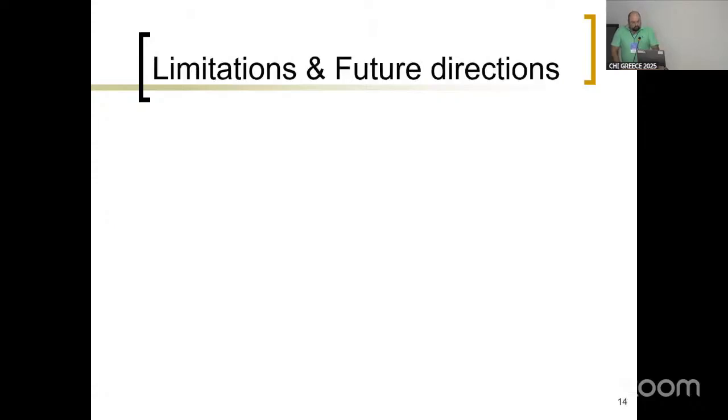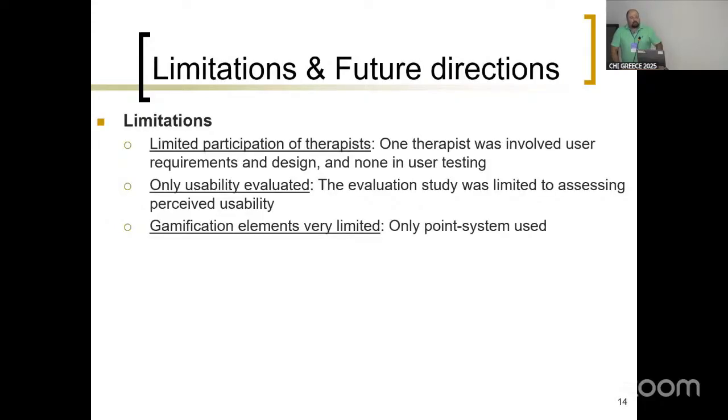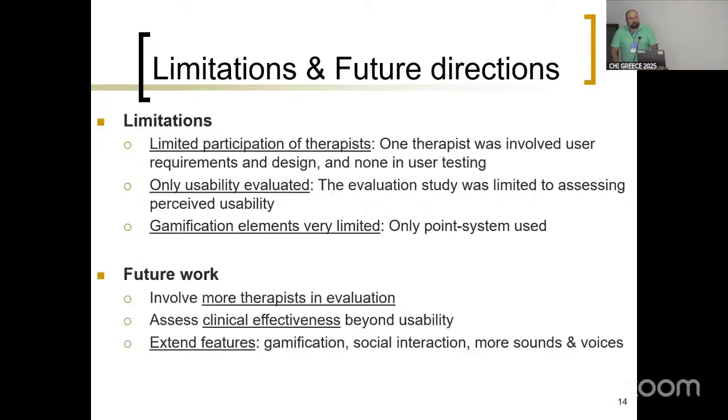So, limitations and future directions. We have limited participation of therapists overall, but also none in the user testing study. Of course, it's not only about usability. We need to address other things. And gamification elements were very limited, although it was a requirement, because we didn't have much time to develop this part. Remember, this is also an MSc thesis, so it's rather academically limited. We plan to involve more therapists in evaluation, assess clinical effectiveness, and extend features.